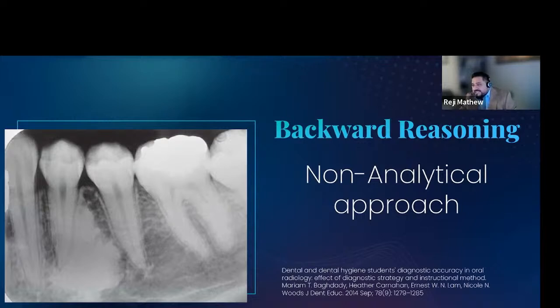Look at those lesions. Think, why would I call it an idiopathic osteosclerosis? Why can't I call it a periapical cementoosseous dysplasia? And what is the difference radiographically, imaging wise, between those kinds of lesions? You wanted to also look at what other lesions could appear radiopaque like that. So try to ask those questions in your mind: why, when, how, age of the patient. Age of the patient is extremely important for some of those lesions. So that is what I wanted to actually show you.